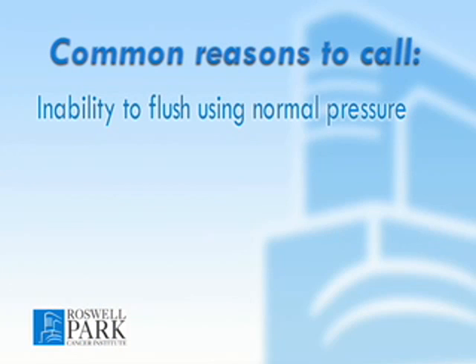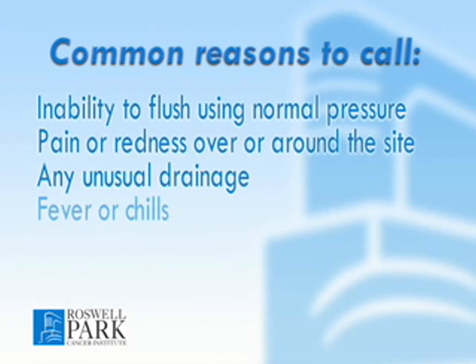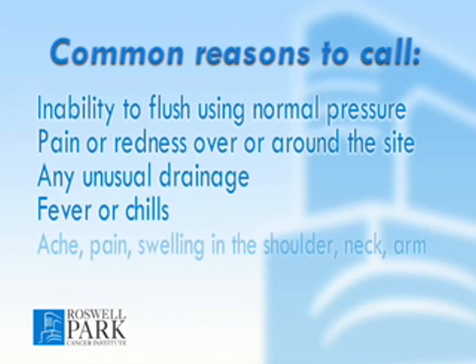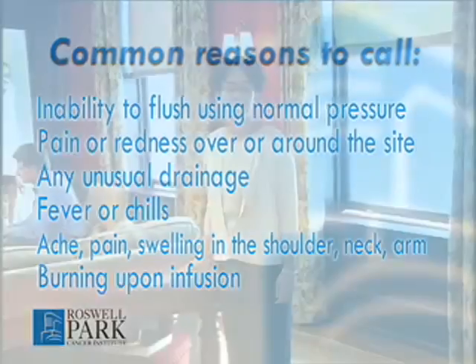Inability to flush using normal pressure. Pain or redness over or around the site or any unusual drainage. Fever or chills. Ache, pain, or swelling in the shoulder, neck, arm, or line site. Burning upon infusion of the medication.